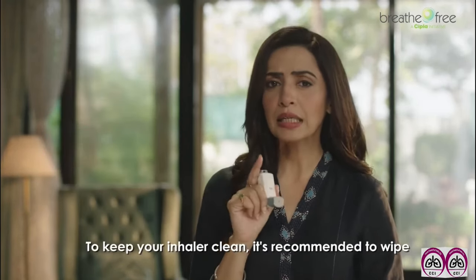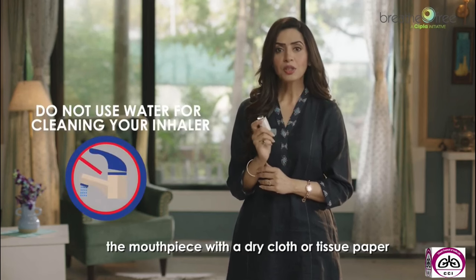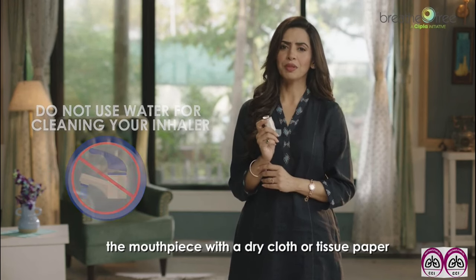To keep your inhaler clean, it's recommended to wipe the mouthpiece with a dry cloth or a tissue paper at least once a week.